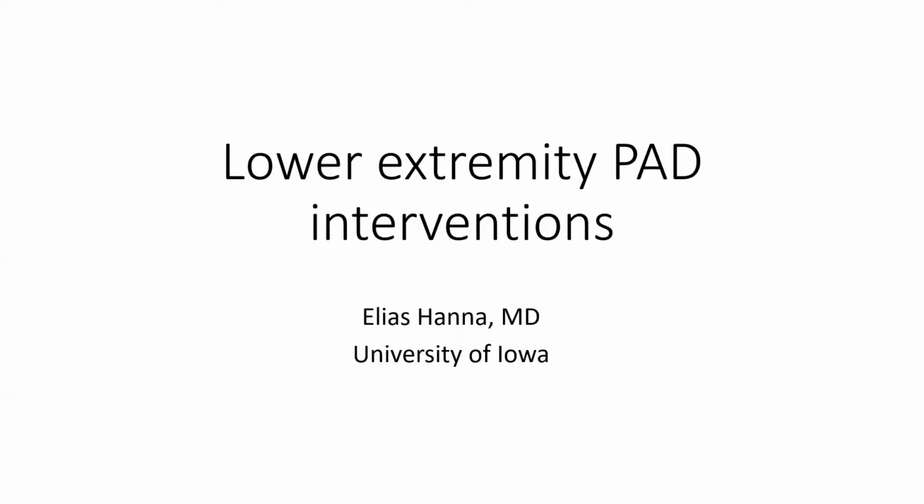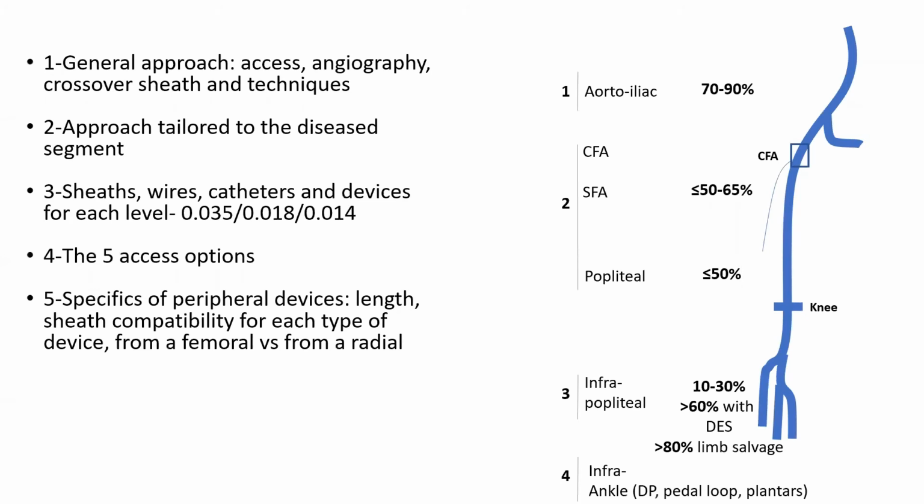I'm going to talk about lower extremity PAD interventions. I will give an overview of PAD interventions from access to crossover techniques to specific treatments of specific segments.